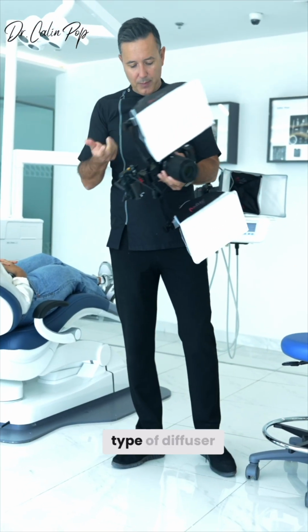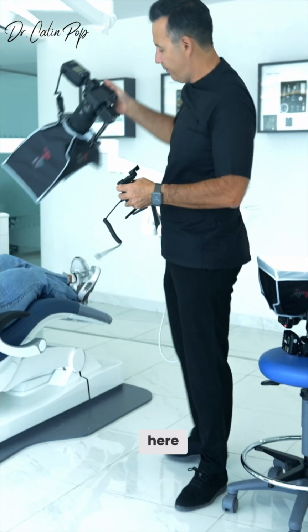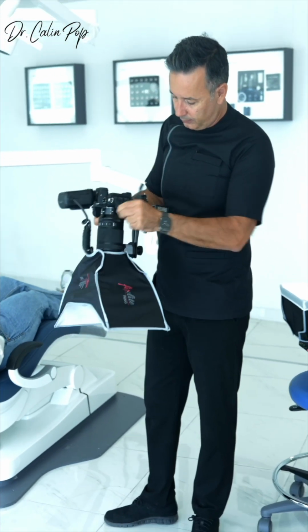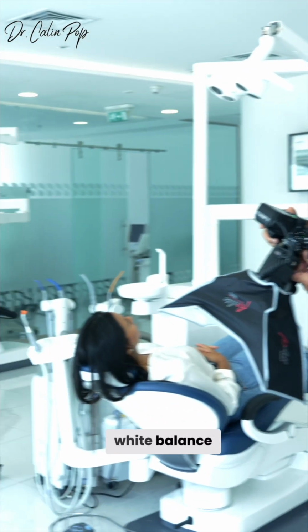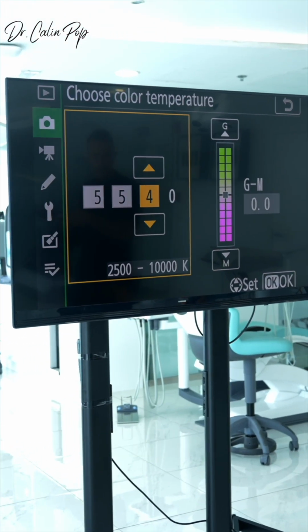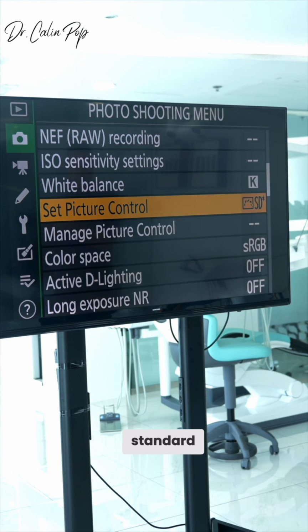Even if I shoot with a different type of diffuser, okay, let me just remove the transmitter and put it on the Fixlite ring. I have the same camera here. All right. Let me just double check what picture profile I have activated on this camera, but before that, let me see the white balance. Yeah, 5500, let's say. So this is the color temperature. I click OK. Set picture control is already on standard. So everything is identical as on the other camera.